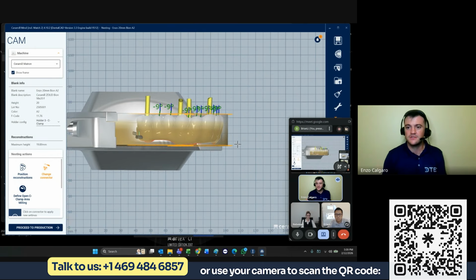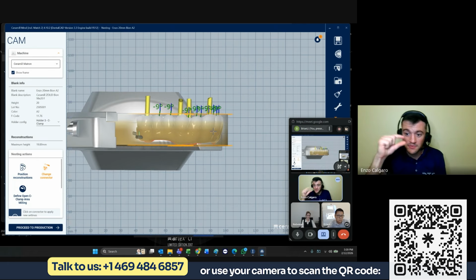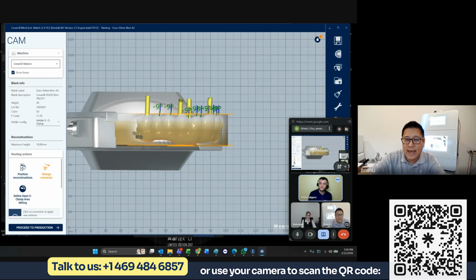And I think that's really interesting. Maybe you don't have the right color on stock and you need a case ASAP. You can maybe play a little bit with the height in case you need to. Yeah, and just to clarify, the puck that I'm using here is a 20 millimeter, but we also have 25 and we also have 30.